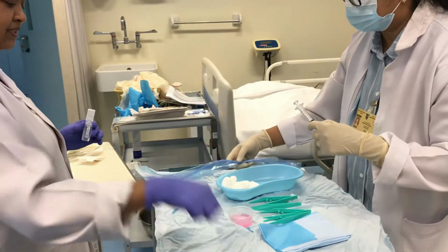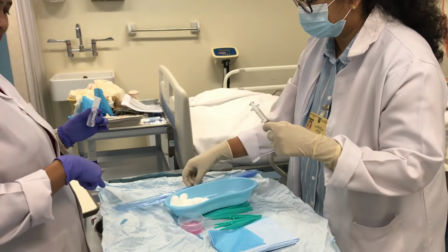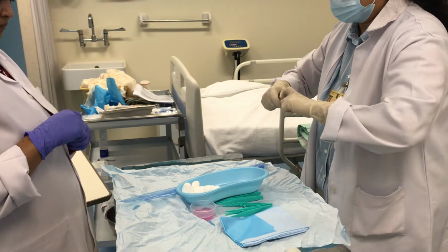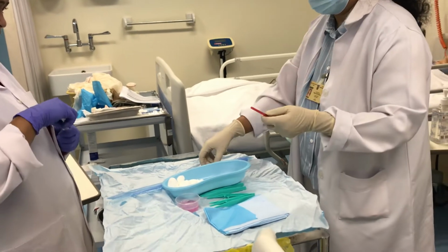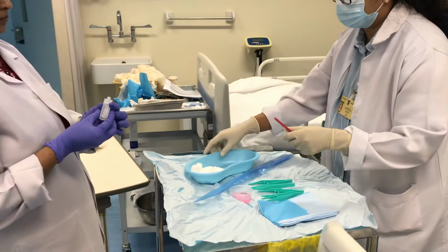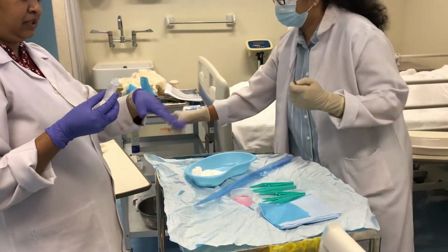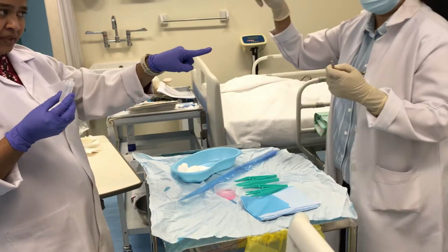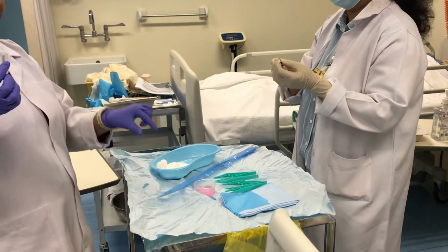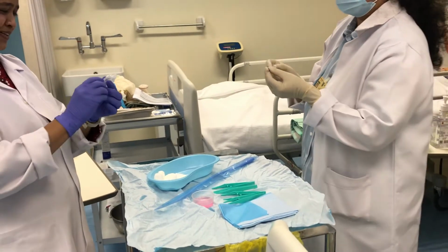That edge is considered to be 2.5 centimeter unsterile, so the article should not come to that edge also. In other countries, if you see the pack, it has a pre-filled syringe with the amount of water they need and jelly, which is what is needed. Everything is there in the pack. We are only not having all these things.